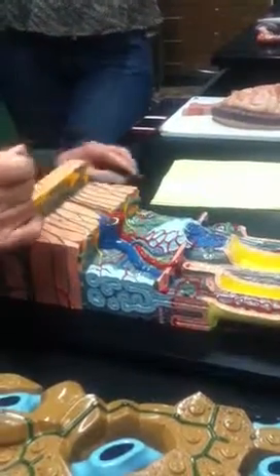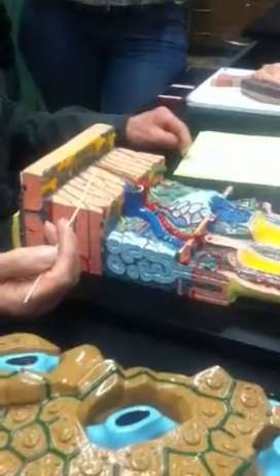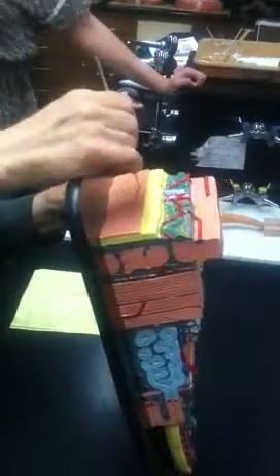Okay, then we have the muscular layer. So these are the circular muscles. You can picture this encircling the whole thing. The fibers are arising, so they go around. Okay, so this is the circular, and this is the longitudinal, goes along the length, longitudinal muscle layer. And in between is the Auerbach plexus. Muscularis, circular, longitudinal, Auerbach's, and then the serosa out here, these flat epithelial cells, squamous epithelial cells, that's serosa. So this isn't so tough.